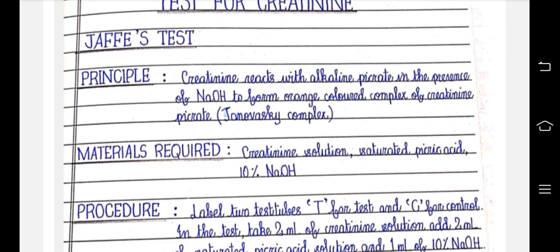That is the Janowski complex. Materials: creatinine solution, saturated picric acid, 10% NaOH. Creatinine reacts with alkaline picrate in the presence of NaOH to form orange colored complex of creatinine picrate. That is the Janowski complex.